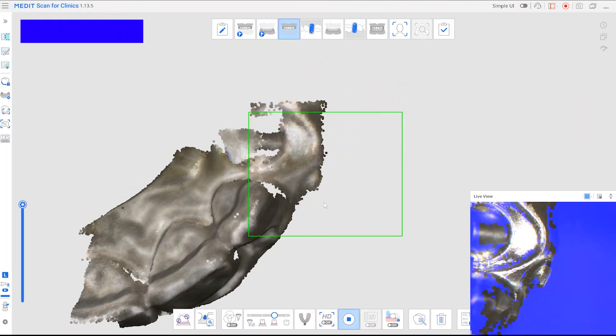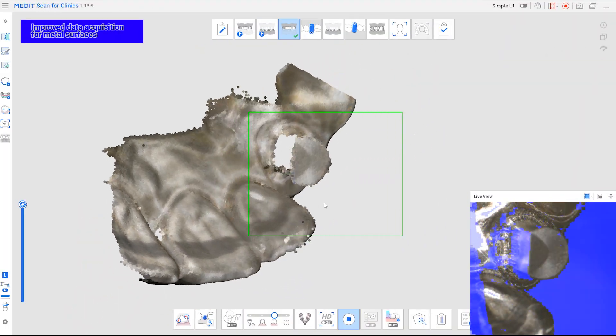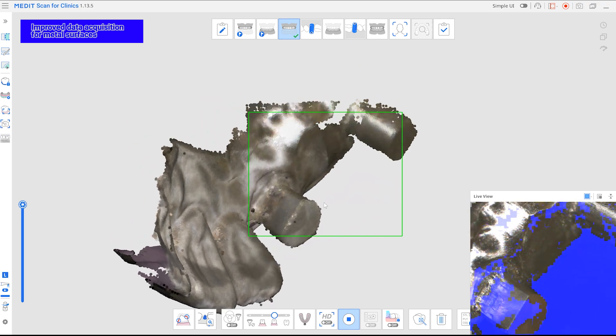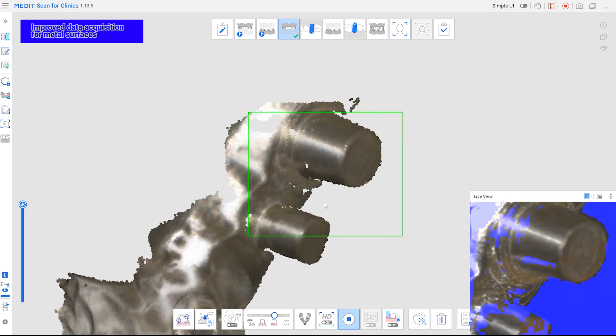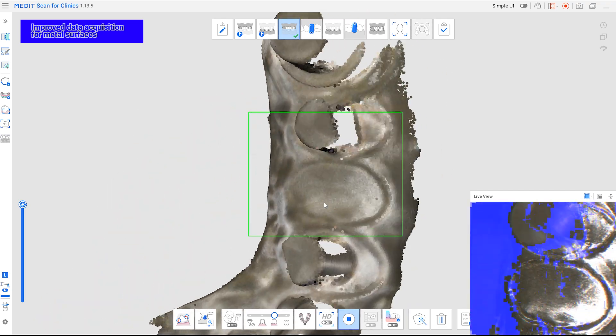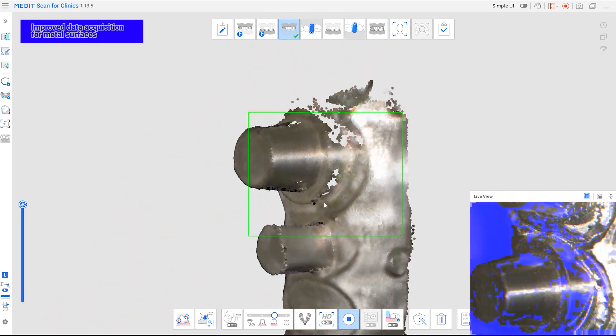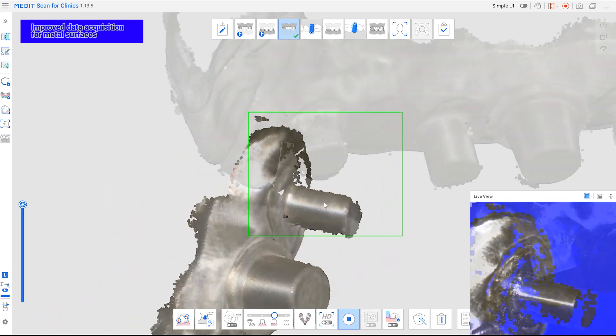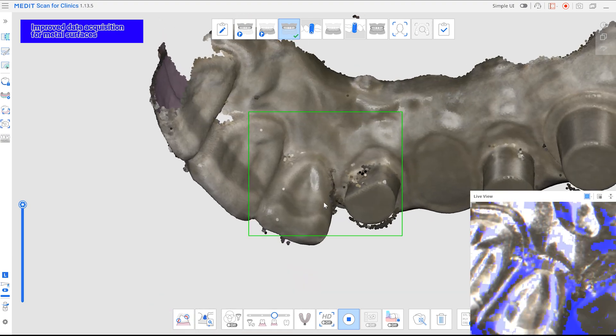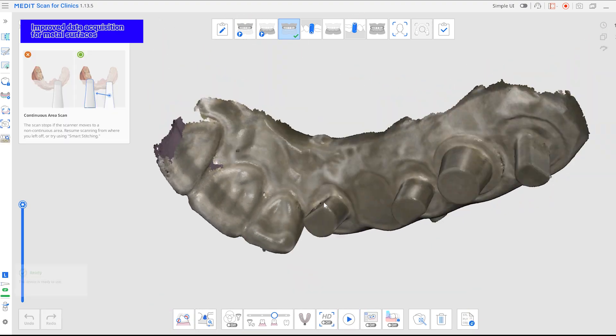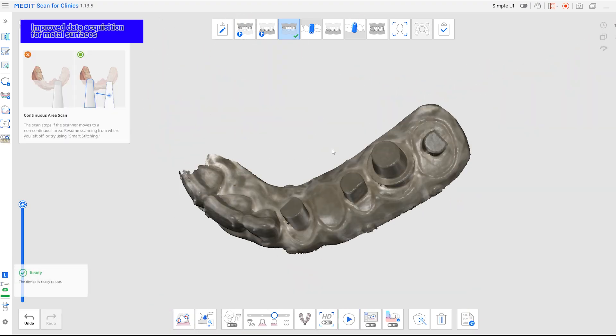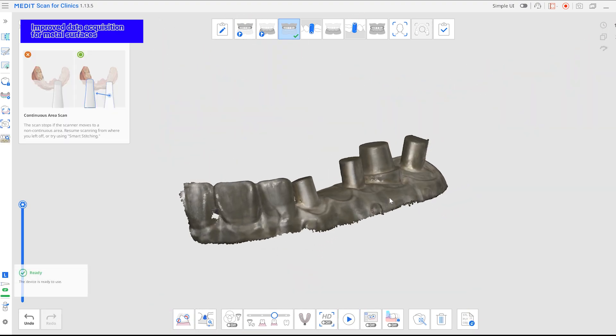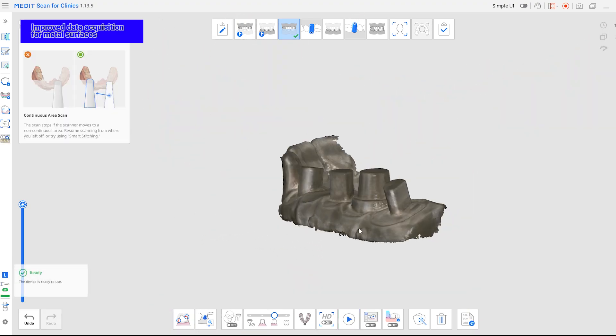We've improved the scan quality for metal surfaces, so you can now capture clear and stable data. Adjacent surfaces and margins of metal abutments, as well as the shape of healing abutments, can now be scanned more smoothly.